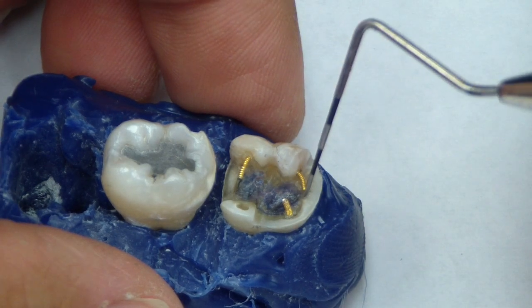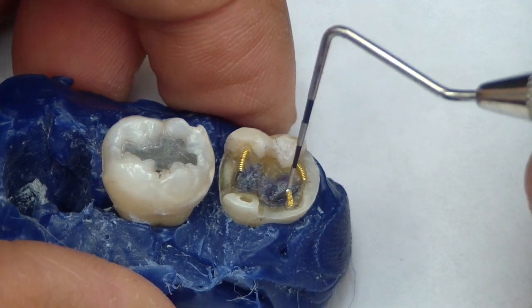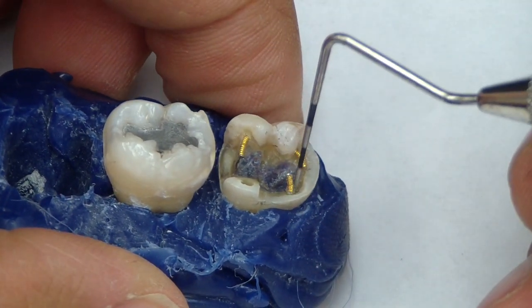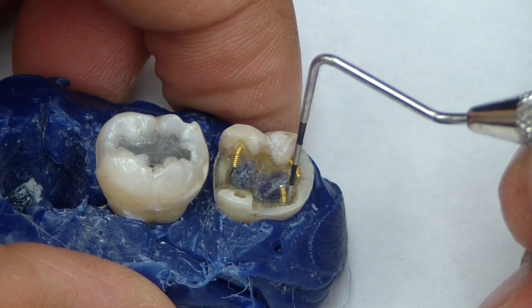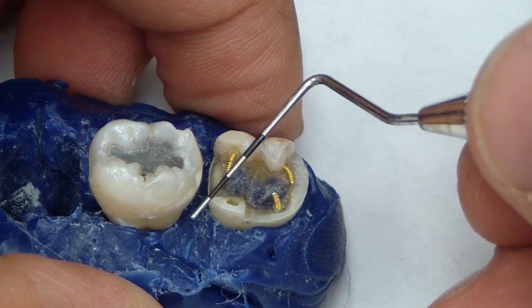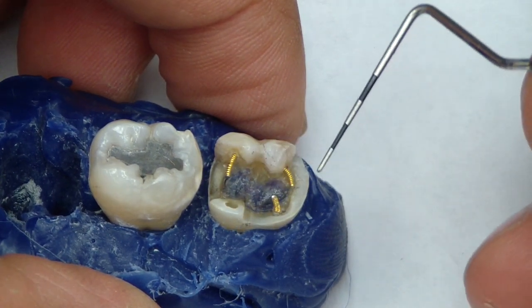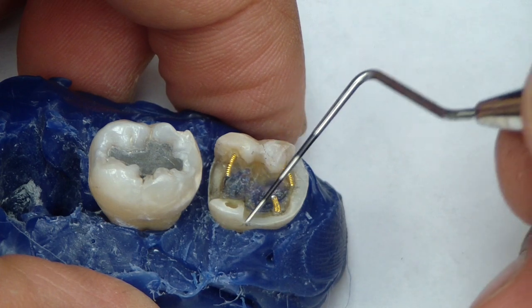So we have some pins — they're very controversial. I place them just for experience. There is no literature that shows they cause failure, but the main concern of most clinicians is devitalizing teeth. We're going to assume that this tooth is still vital and the patient can't afford a full coverage restoration, i.e. a crown, and we're just placing an amalgam.